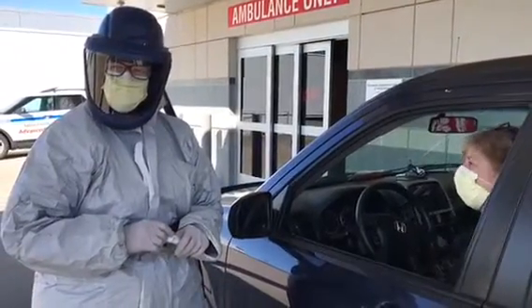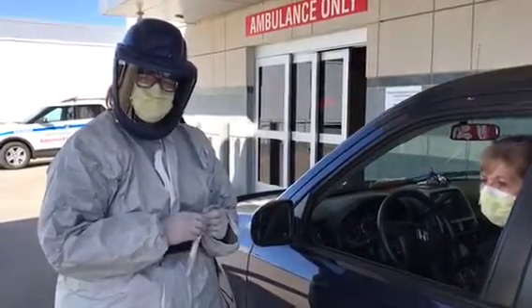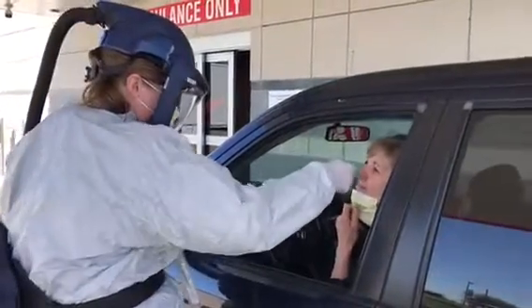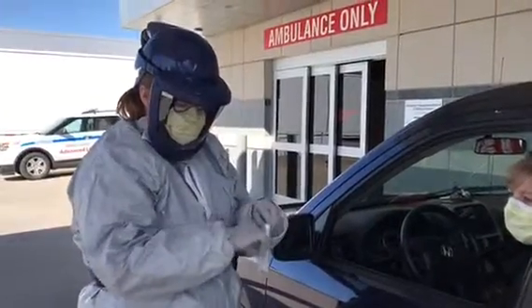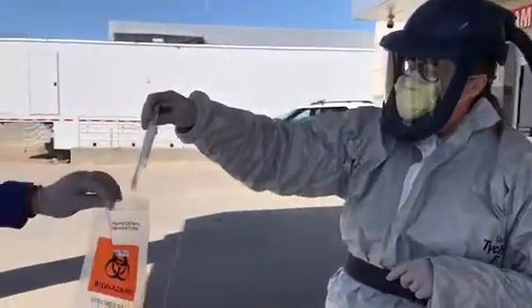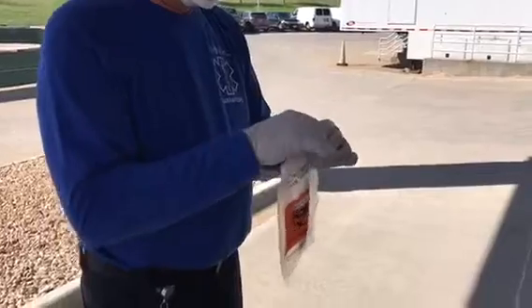The primary nurse is then given the swab kit. The primary nurse opens the swab kit and obtains a nasopharyngeal swab of the patient. She then makes sure she puts the swab into the solution and seals the lid. Depending on the swab you use, you may have to bend the swab stick. She then drops the sample directly into a biohazard bag that is sealed by the secondary nurse.